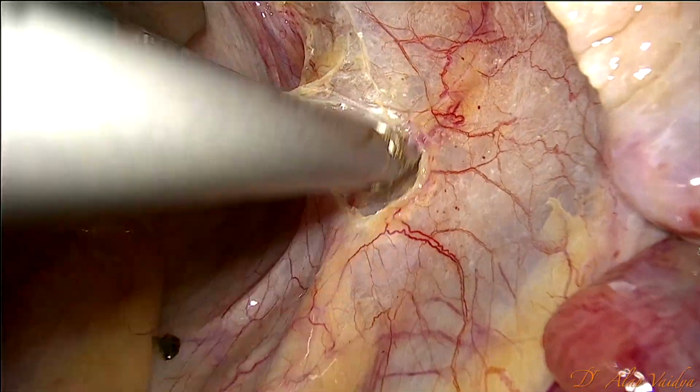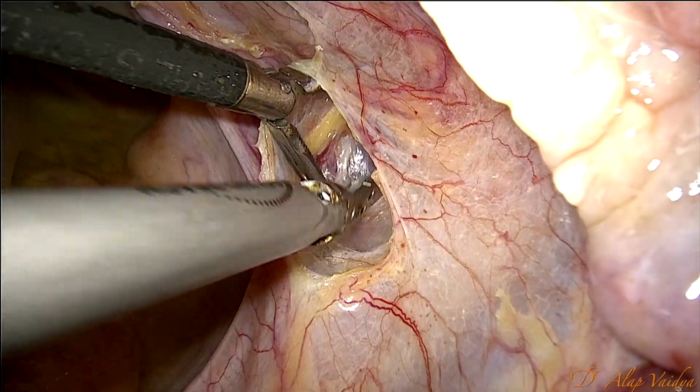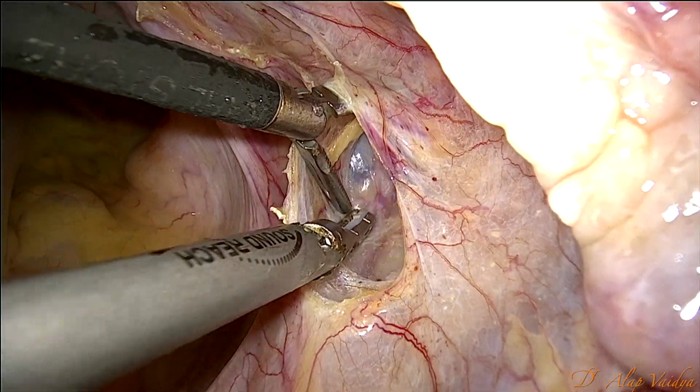Identify the ureter, poke in the fibrofatty tissue and retract, and mostly you will see the uterine.